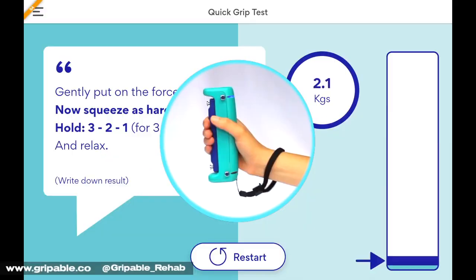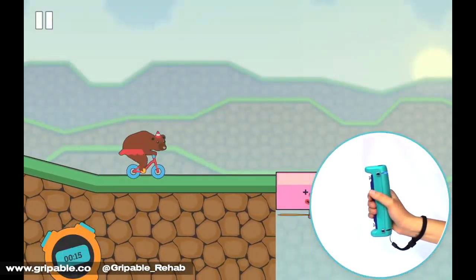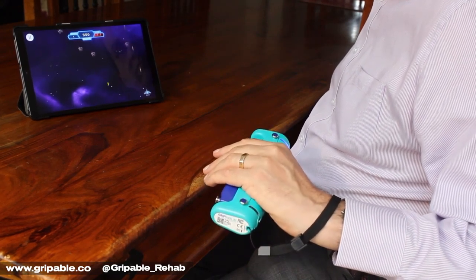Introducing Grippable, the two-in-one assessment instrument and training device that entertains while you train. This smart hand-held instrument connects wirelessly to a mobile app.